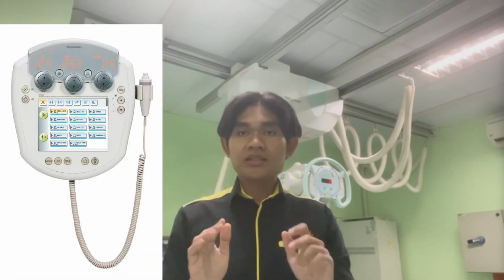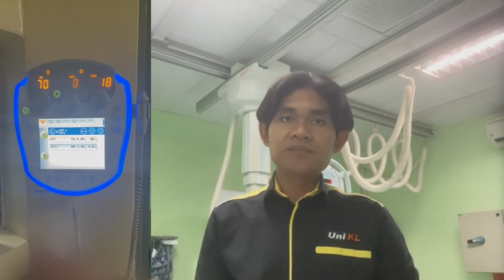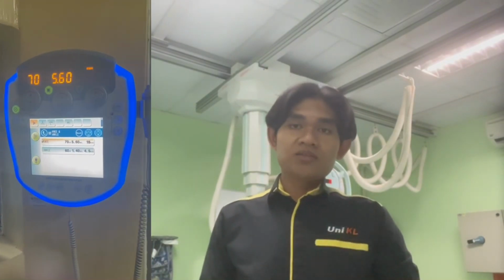So, what is an X-ray control panel in an X-ray machine? An X-ray control panel means a device which controls input power to the X-ray high voltage generator to the X-ray tube. It includes equipment such as timer, phototimer, automatic brightness stabilizer, and similar devices which control the technique factors of an X-ray exposure.